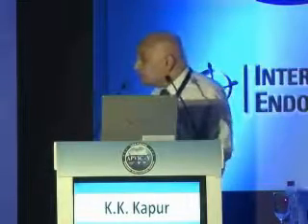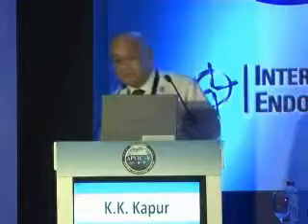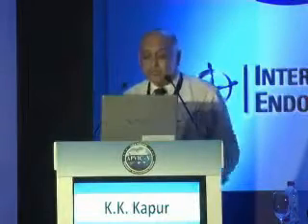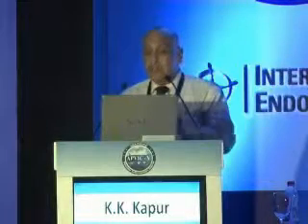And of course the addition of color Doppler adds only marginally, by 5 to 6%, to improving these results. So the major impact is actually on a B-mode ultrasound examination. We look for venous incompetence, and you can do various straining maneuvers: the Valsalva by blowing into a sphygmomanometer, a cough, or an abdominal strain, and it can be performed in the supine or the standing position.